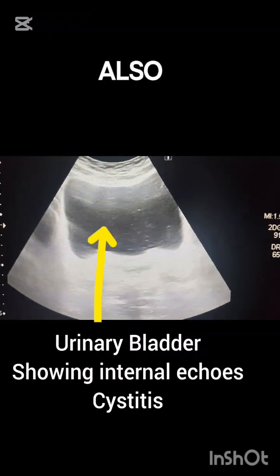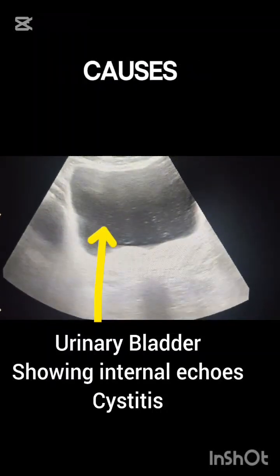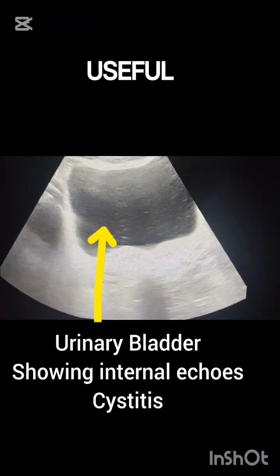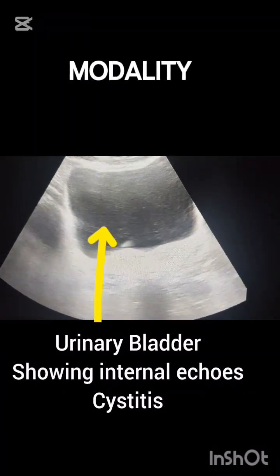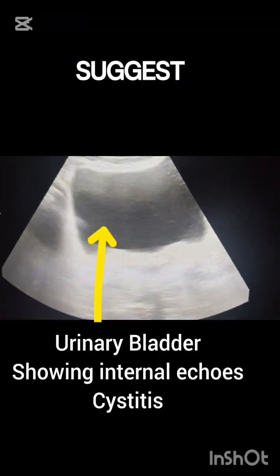Overall, cystitis is an inflammation of the urinary bladder, commonly caused by bacterial infection, but can also be related to irritative, chemical, or interstitial causes. Ultrasound serves as a useful, non-invasive modality for evaluating the bladder and detecting features that may suggest cystitis.